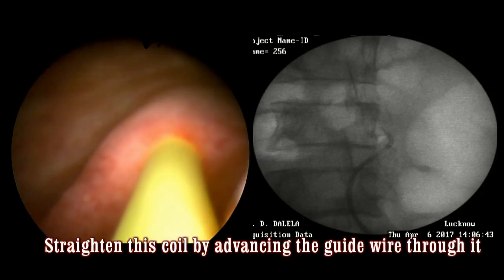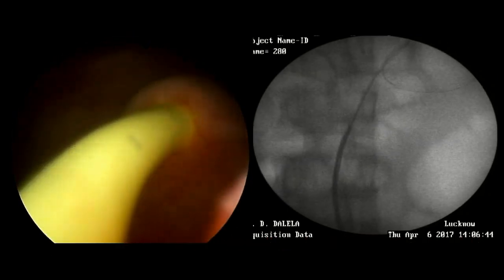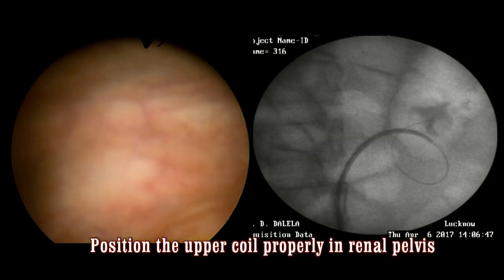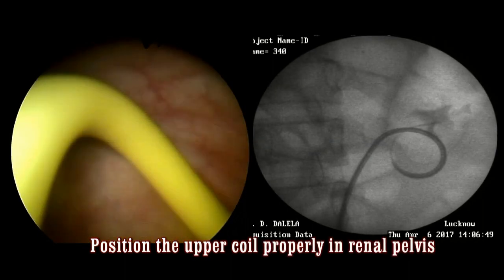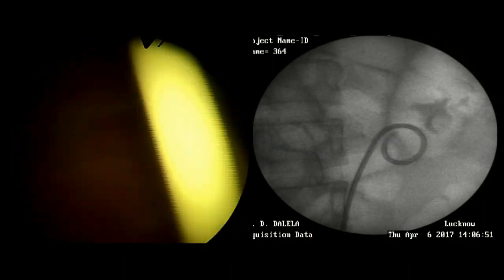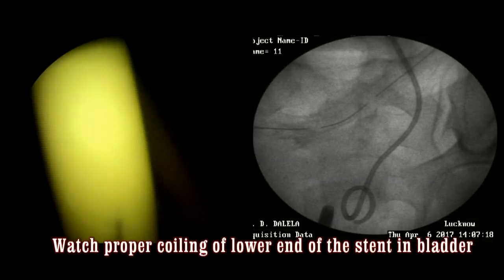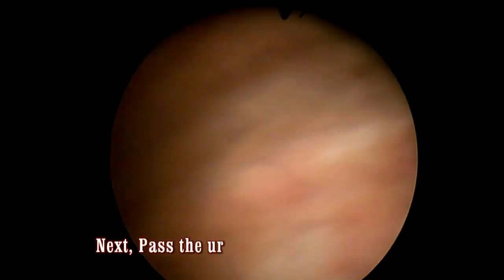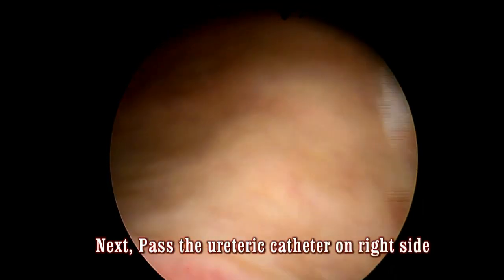Sometimes the upper end of the stent gets coiled in the middle of the ureter. In that case, pass the wire into the stent again and let it coil well in the renal pelvis. Once you are satisfied with the positioning of the upper end, withdraw the guide wire and also check the proper positioning of the lower end of the DJ stent.